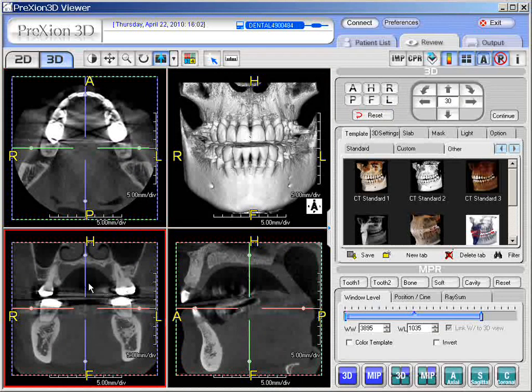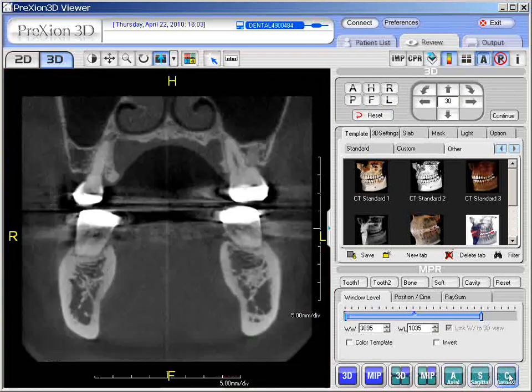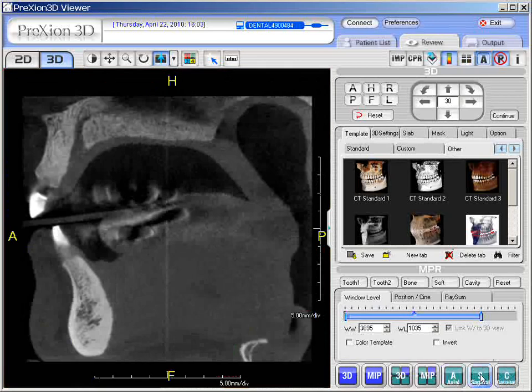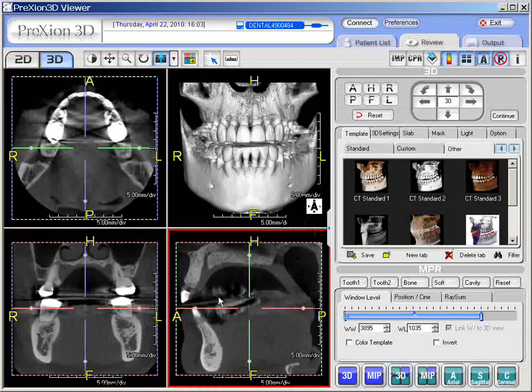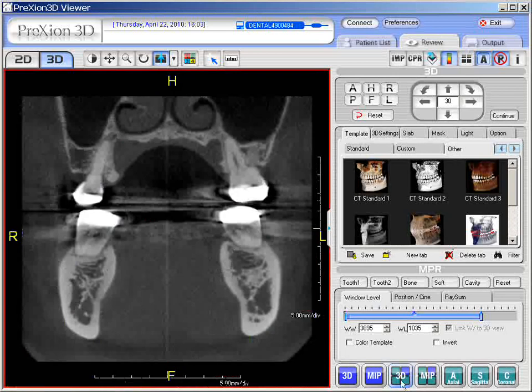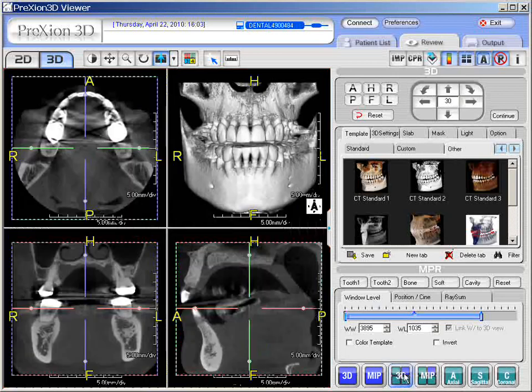Same thing for the coronal screen. However, you can also select these icons in the right-hand corner. So if we wanted to just select coronal, we can simply press C, and we've got the coronal section highlighted. For sagittal, just click the letter S. Again, A for axial, or if you want to go back to the original, double left click it, or you can simply click this icon with the four screens and click it once to go back to the original default positions.